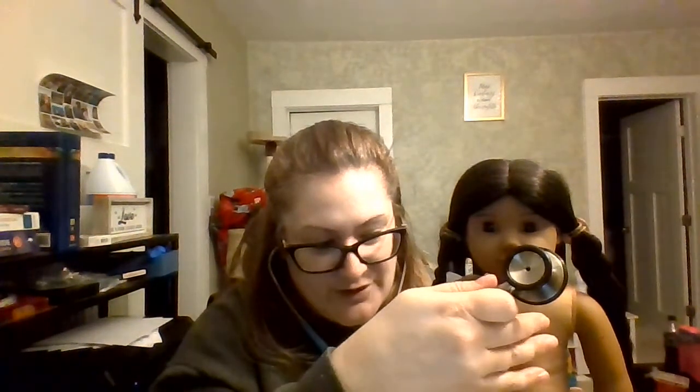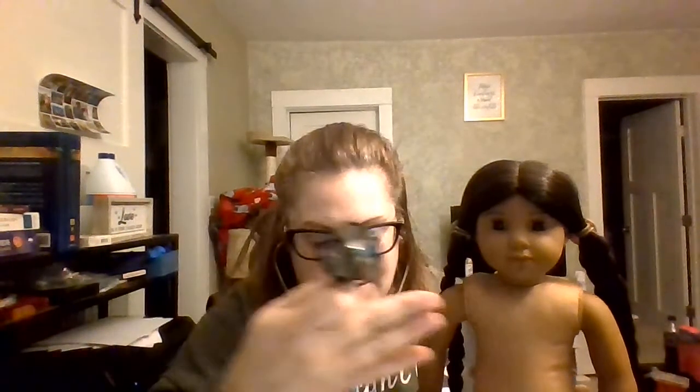So I'm going to stay in that same intercostal, and I'm going to go over so I can hear and auscultate the pulmonic valve. I can actually hear the heartbeat through my hand. Oh, that's weird. So then you want to go down another, would that be 2 or 3, to go to the 4th or 5th intercostal, still along the sternum.